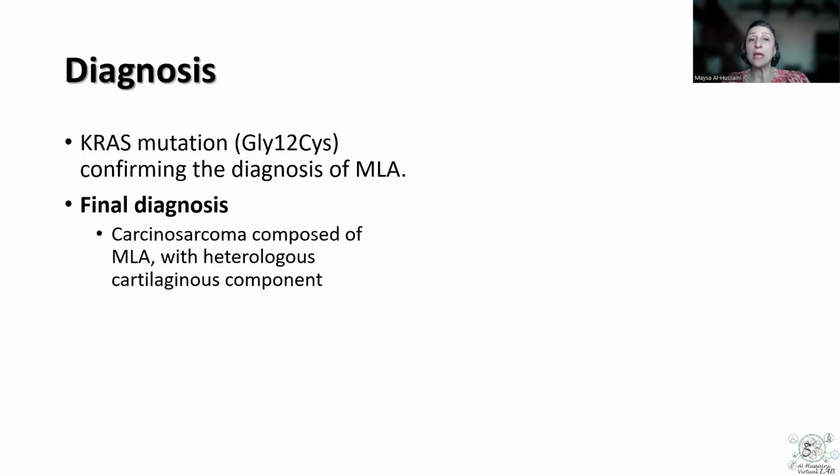of the endometrium. Now, what we did next is confirm the diagnosis by performing molecular testing, and the tumor showed a KRAS mutation. The final diagnosis, because of the presence of the heterologous cartilaginous component, was rendered as carcinosarcoma, composed of mesonephric-like adenocarcinoma with heterologous cartilaginous component.